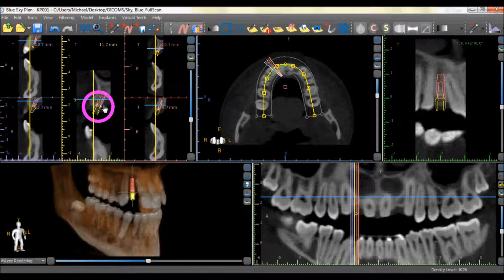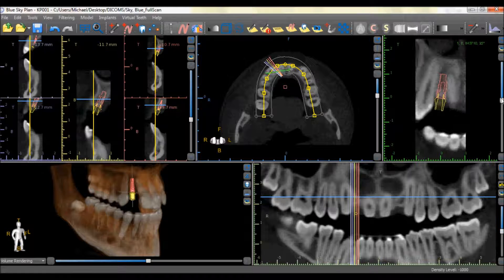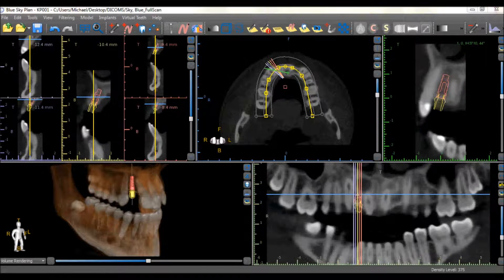The tangential view can be used to view 360 degrees around the implant. A second implant can be placed by once again clicking on the Add Implant icon in the horizontal toolbar.